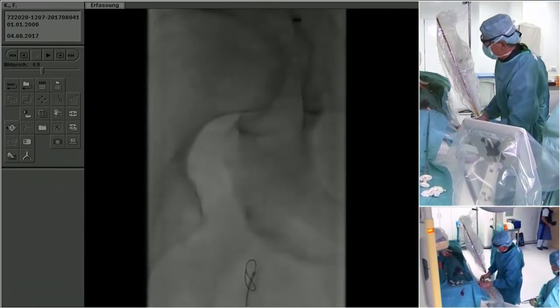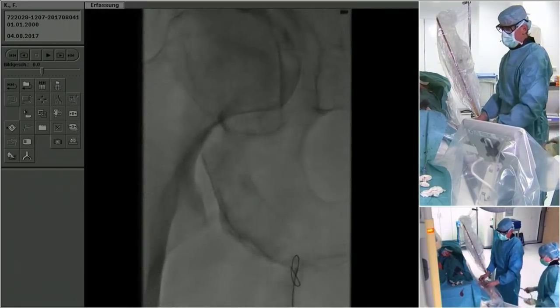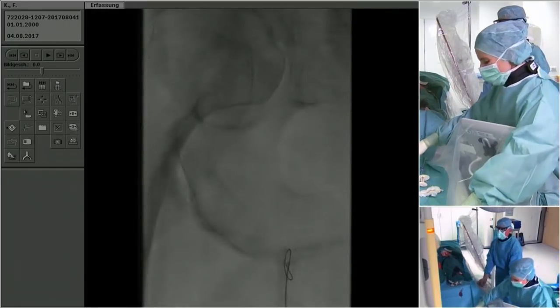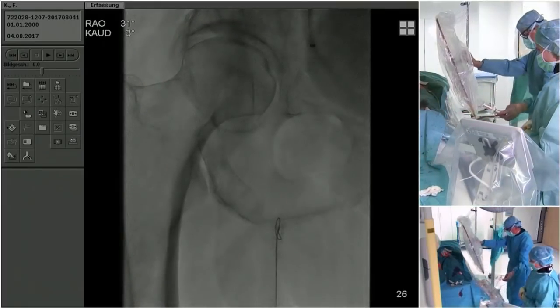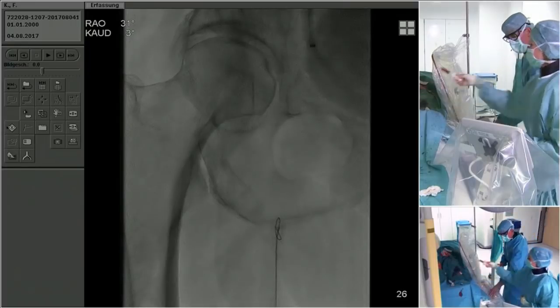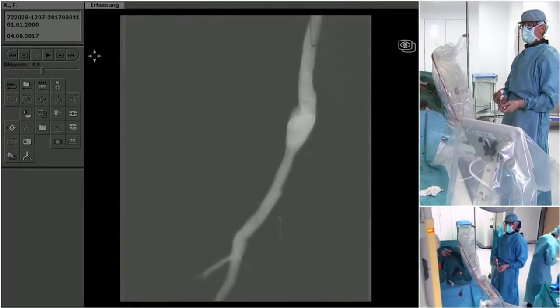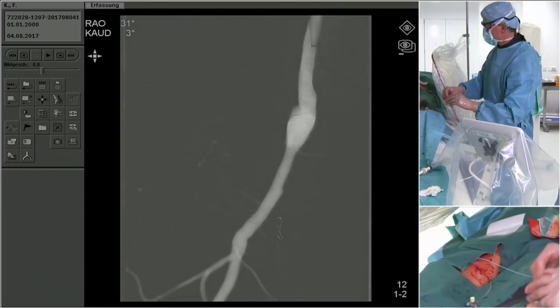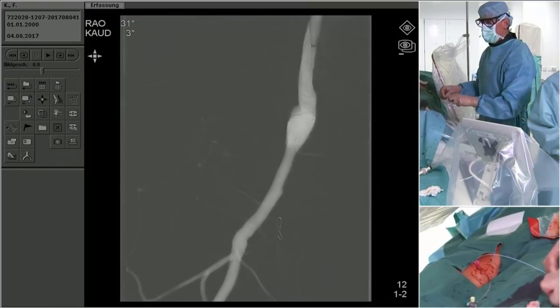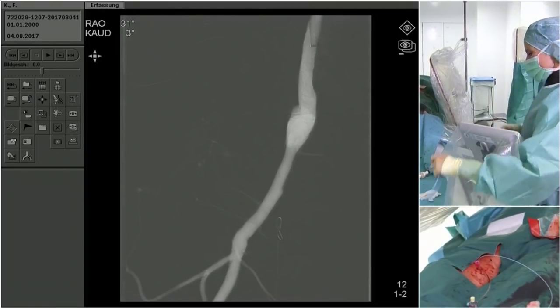What do you think? Where the artery, I think so, is cut. Anyone in the panel? Mehdi, do you have a specialized approach in these situations? I don't think I've ever done a case with the transection, but actually I know I haven't done a case like this before, so I think that he's going to end up using the needle, the Brockenbrough needle, because I don't think the devices are going to be able to go through.